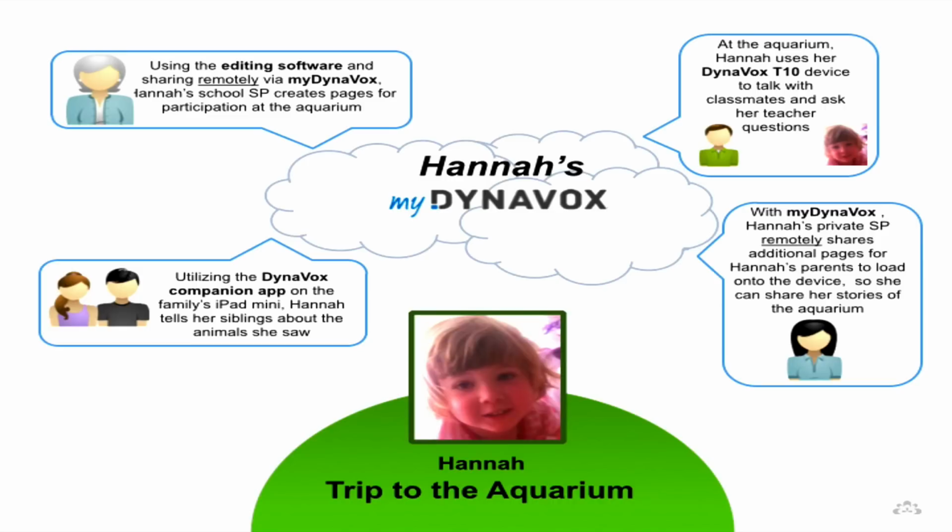And then she's sharing those pages to Hannah's family's MyDynavox account, so they can access them and put them on the iPad that she has. They can also put them on the T10, and that's what's happened in the top right-hand corner. The school have put those pages onto the T10 device through the MyDynavox account. Anything on MyDynavox account is in the cloud and accessible by those people that work with Hannah. And so Hannah's using the device at the aquarium to ask her teacher questions and talk with her classmates.